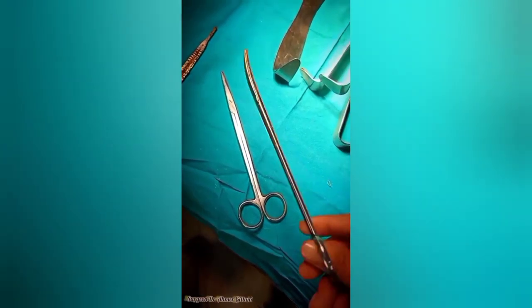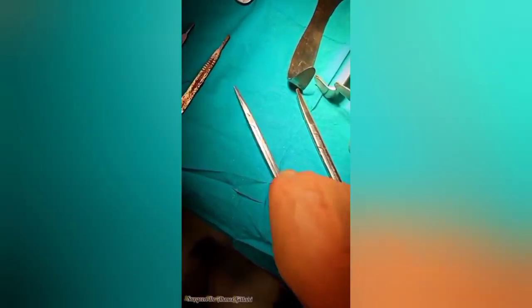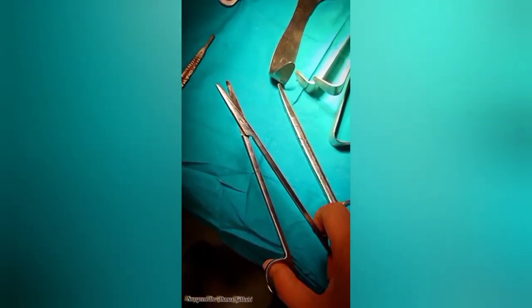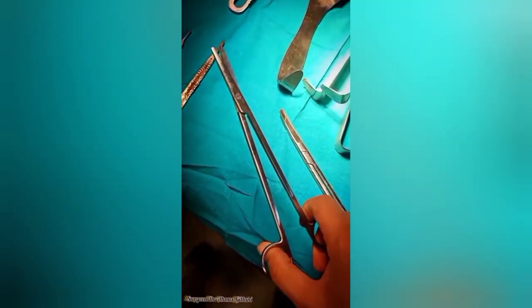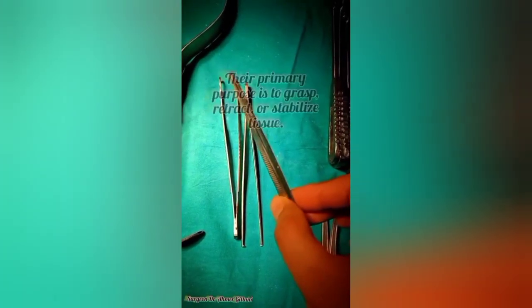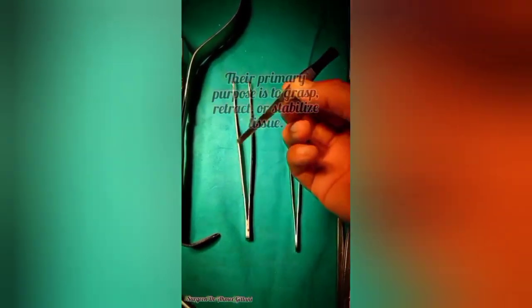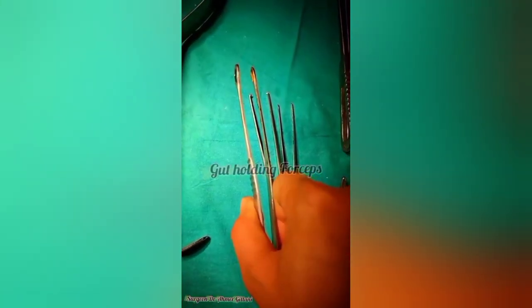Now we have the curved Mayo scissors and the straight Mayo scissors. The straight Mayo scissor is used to cut dressings, while the curved Mayo scissor is used to cut the rectus sheath muscle and fascia. Then we have plain forceps, used to grasp and stabilize tissues. Next are tooth forceps, which have pointed teeth on their ends and are used to hold tissue while suturing. This is the gut holding forceps — non-traumatic and totally gentle — used to hold the gut.